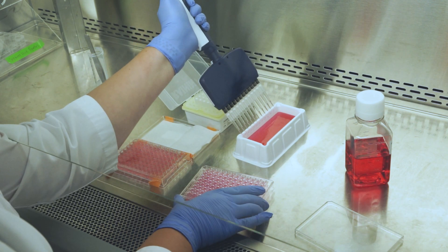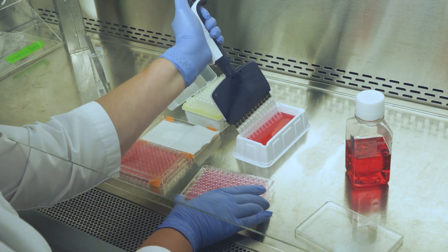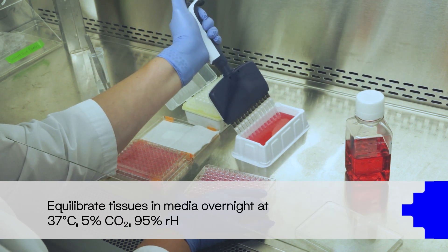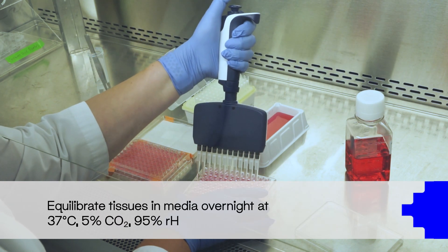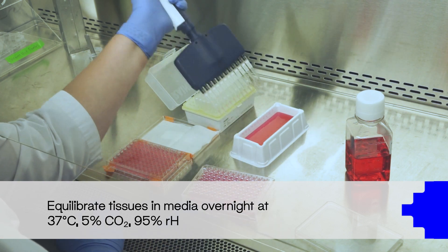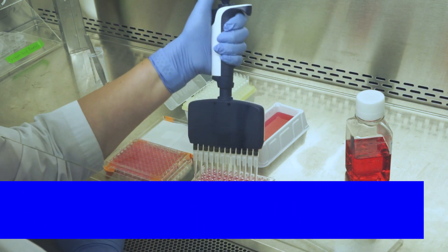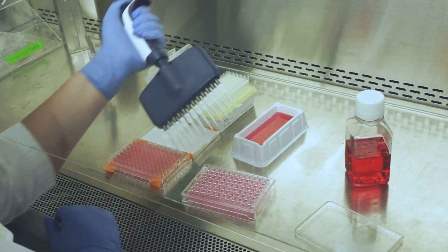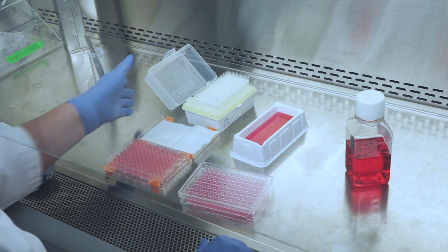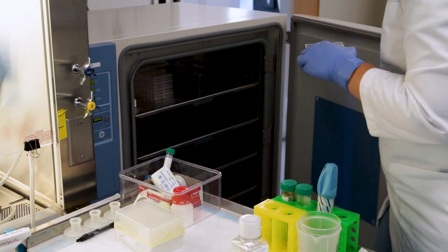Once media has been topically placed onto each of the tissues in the plate, place the plate in an incubator at 37 degrees Celsius, 5% CO2, and 95% relative humidity for overnight equilibration, approximately 16 to 18 hours. After overnight incubation is completed, tissue equilibration is now complete, and your Epi-Intestinal tissues are ready for your experiment.